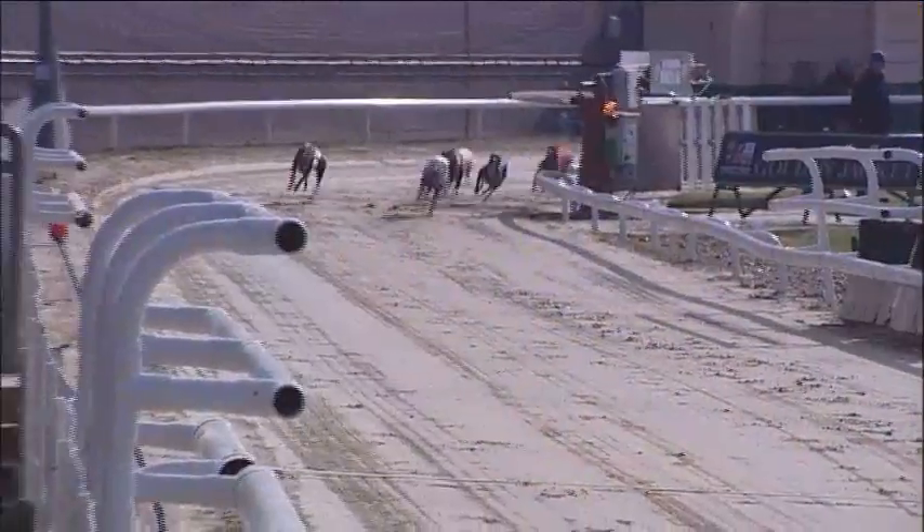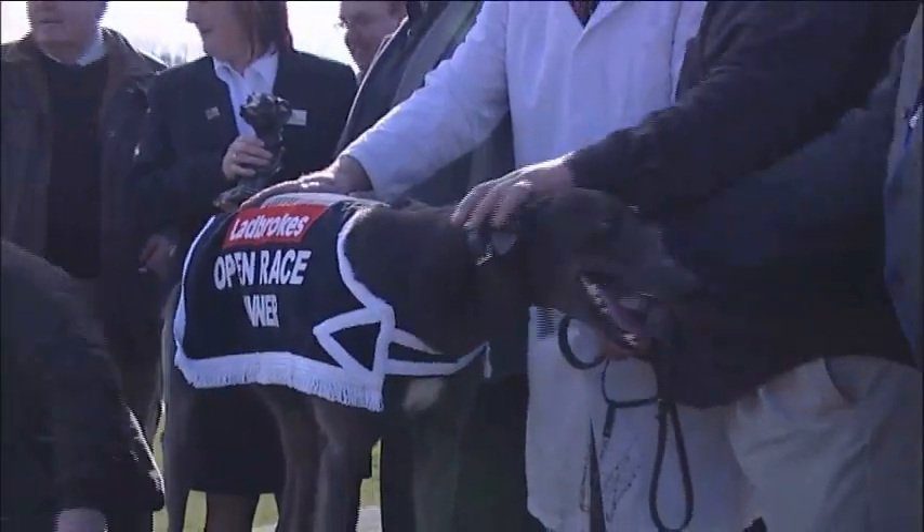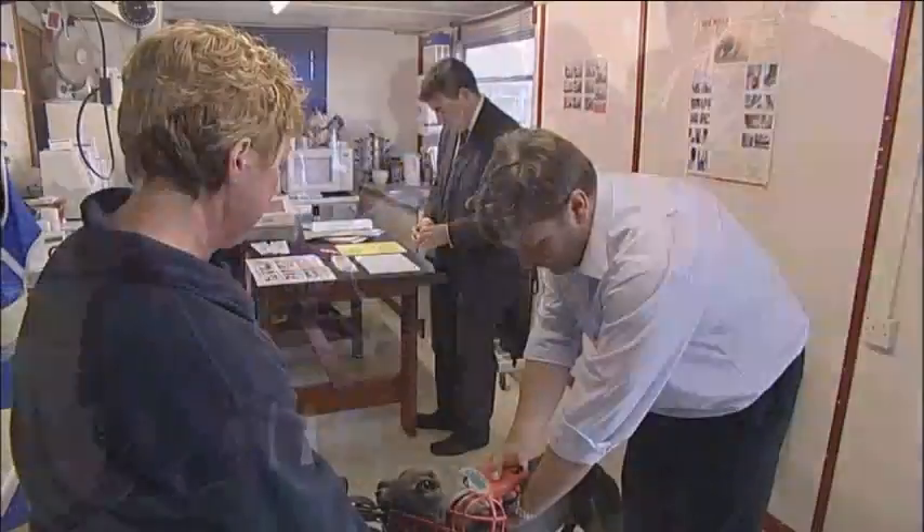It's important to remind the trainer that three clear days must elapse between the implantation of the microchip and the dog's next trial or race. This allows the microchip to settle and bind in place, reducing the risk of it migrating.